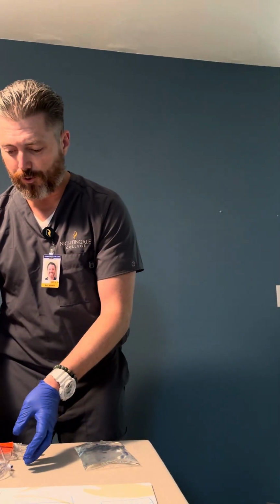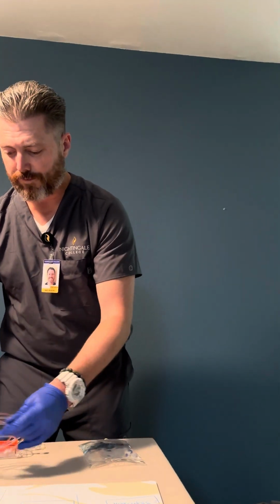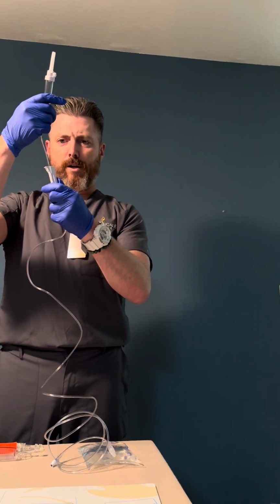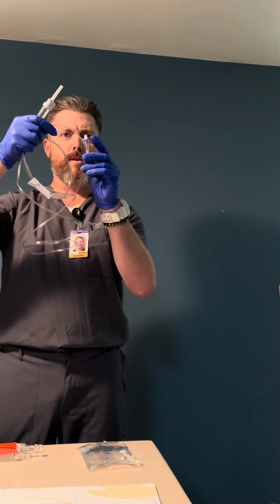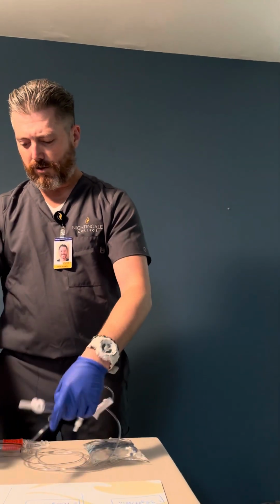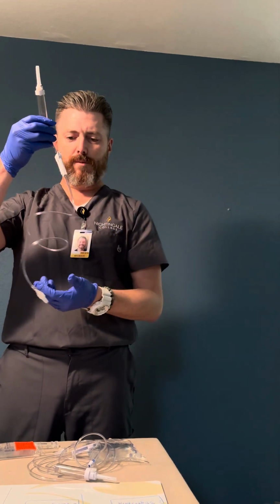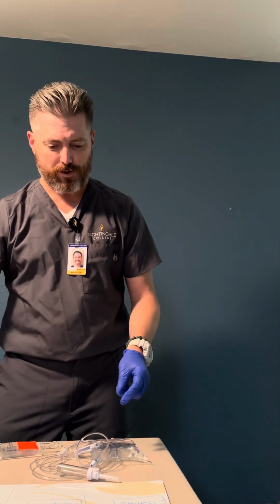Speaking of drip chamber, I will go through the parts of our IV tubing. So this is our spike end. This is the drip chamber. Got our roller clamp right here. This is the Y site and our adapter end. And on our piggyback, it's very similar. We've got our spike end, we've got our drip chamber, roller clamp. There's no Y site, but there is the adapter end, and that's going to go into the Y site of this one.